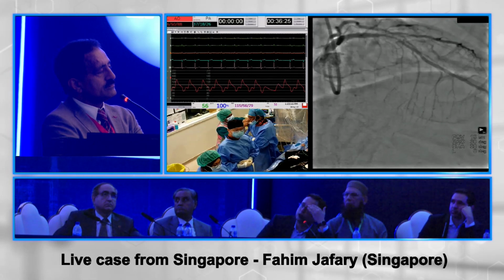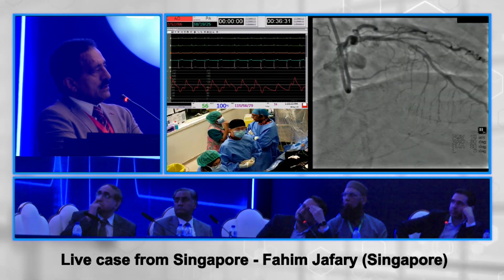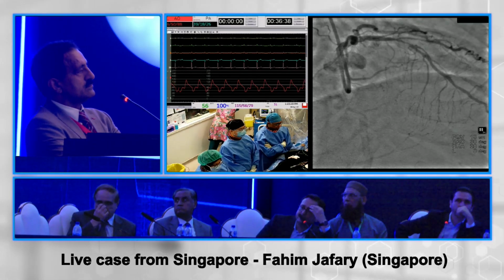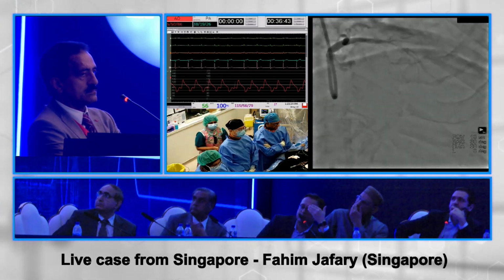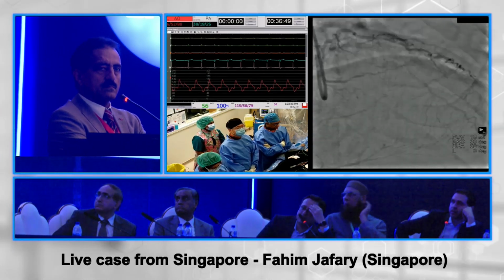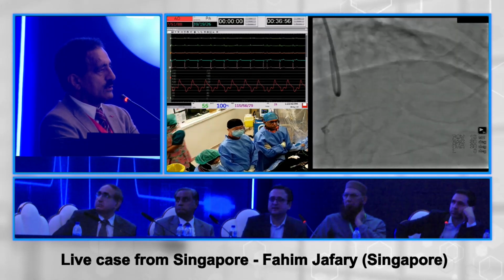You don't want an underexpanded stent in that LAD when it's the main vessel supplying everything. But you probably will need to IVUS that diag as well to see if you need a cutting balloon or can you just do it with an NC balloon. Definitely, whatever hemodynamic support you can get. I see a balloon pump there already on the latest images, so probably that's what they've gone with. Impella would have been even nicer, but again, depending on availability. So imaging, atherectomy for sure, and then hemodynamic support for sure, yes. Numan? And a 2-stent strategy.